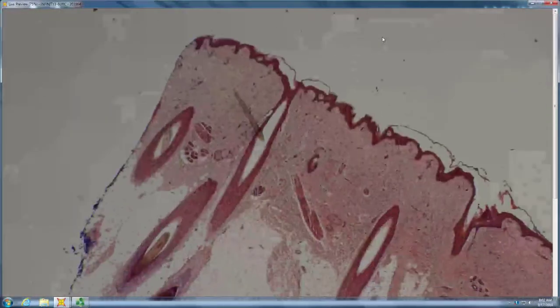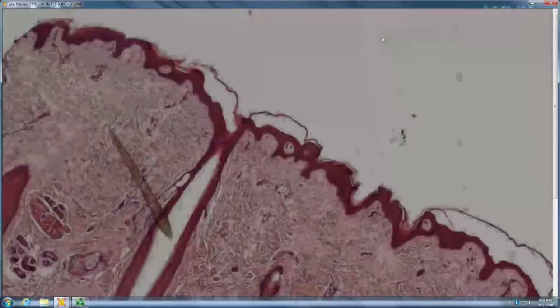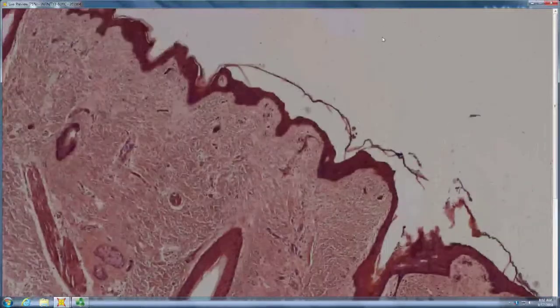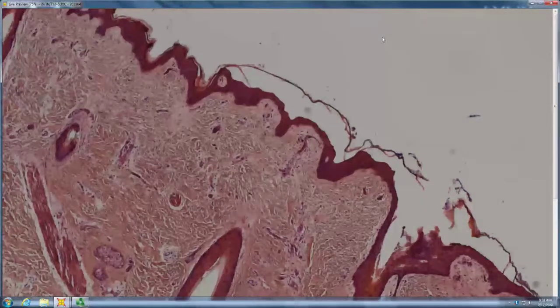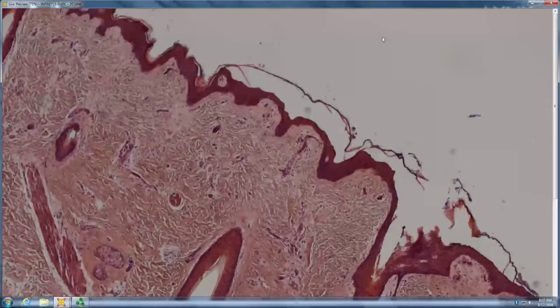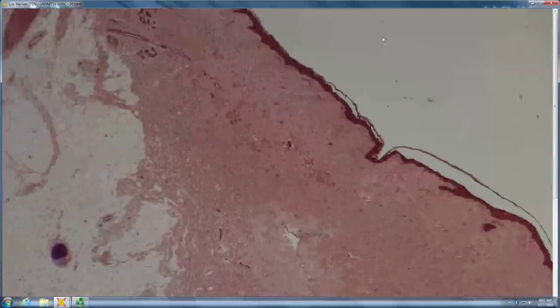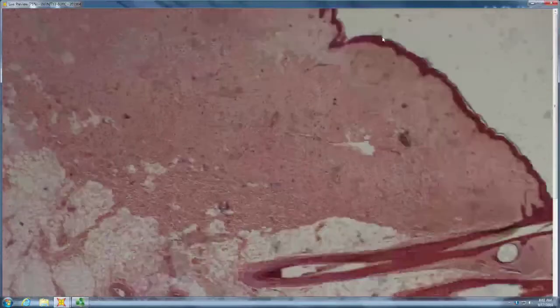Okay, where are we? The hair-bearing area, probably maybe the scalp. Scalp. How old's the patient? I think young. Old. Okay, so you had a 50-50 chance. Okay, so is the collagen normal sized and pink or small bundles that are fairly red? Small bundles that are fairly red, yeah. So it's kid skin. Okay, and so you got scalp, and then what's wrong with the scalp? So it's missing some hair.